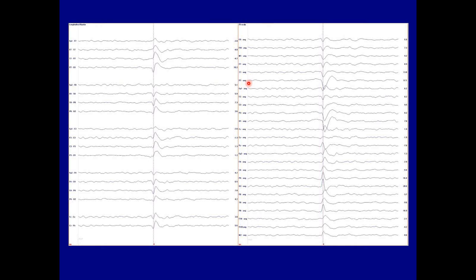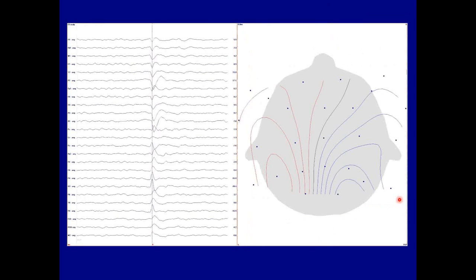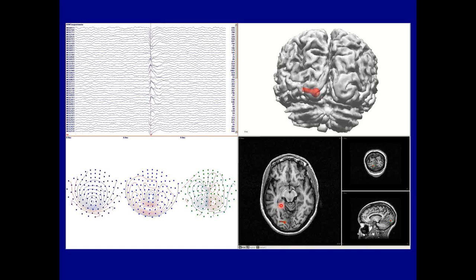Another confusing EEG example, here in bipolar EEG, again, there's no phase reversals. That's the problem. And in common average reference, we see positivity on the left side and negativity on the right side. Okay, that's great. Do we go with one? Do we go with the other? The field is, again, tangential. So you can't go with either. This source is not under the negative or the positive maxima. It's between the two, much the same as with MEG.